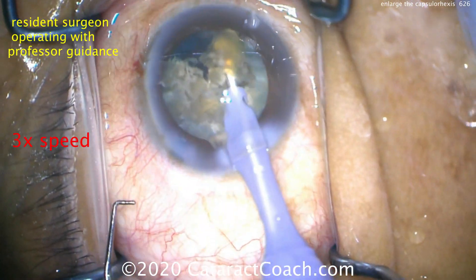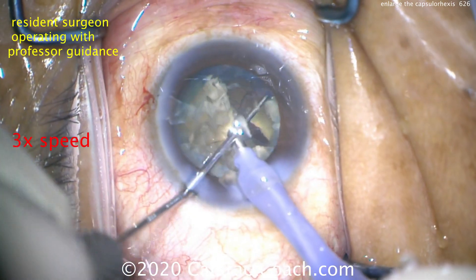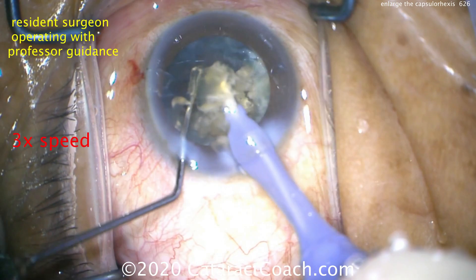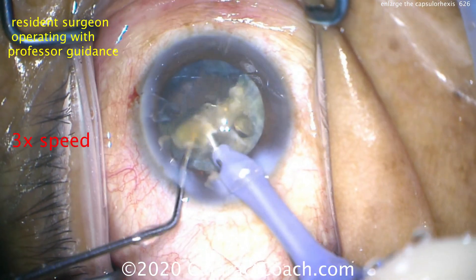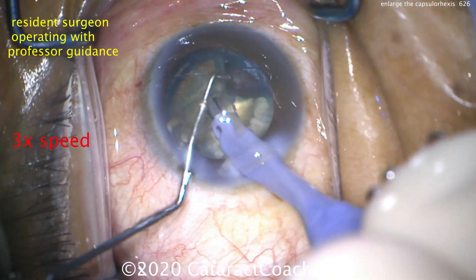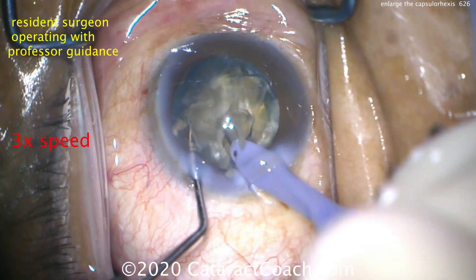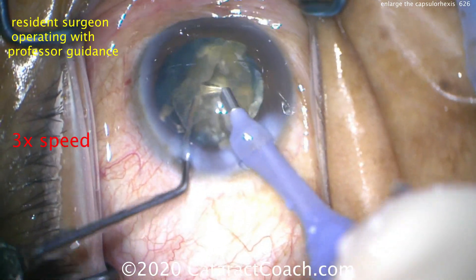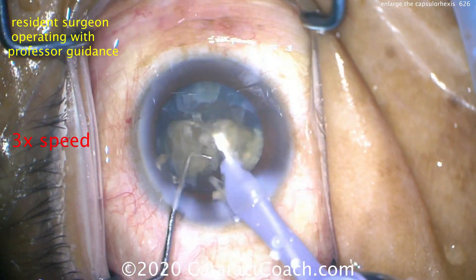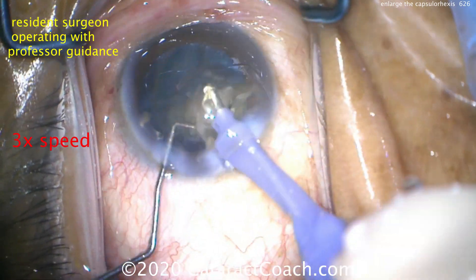Now it's much easier to remove this dense cataract and these dense nuclear pieces through the larger capsorhexis opening. Remember, this is a dense cataract — it's not going to have a small, dense endonucleus. The whole nucleus is going to be dense. So it's a larger diameter, and by having a larger capsular opening, it makes it a lot easier to get these cataract pieces up to the iris plane where we can emulsify them, chop them.